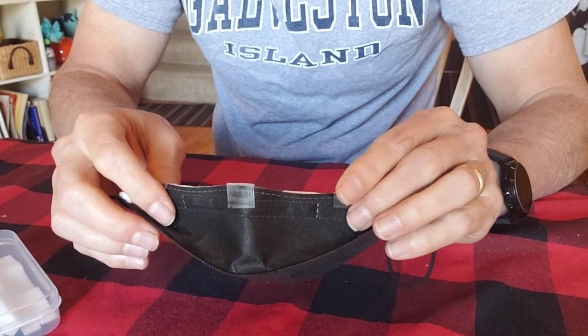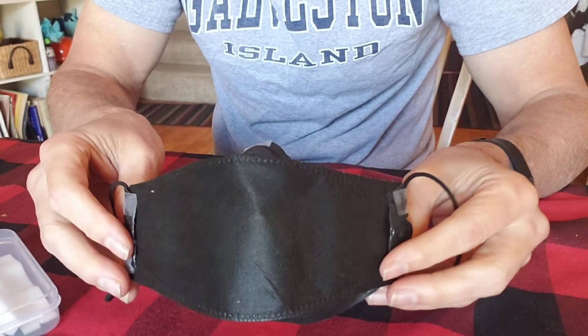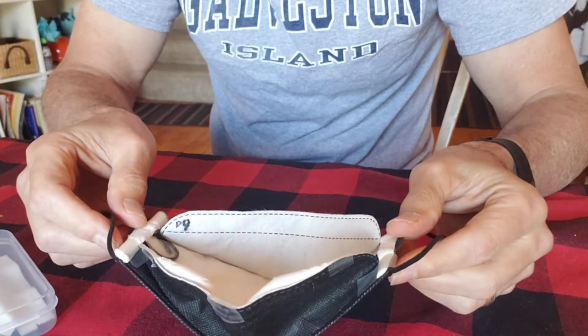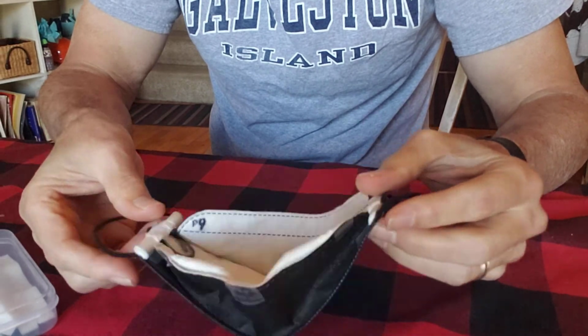And after all that, other than that, I've worn these for 4 days, 10 hours each. Works like a charm. It is a real good seal. I'm really happy with it.